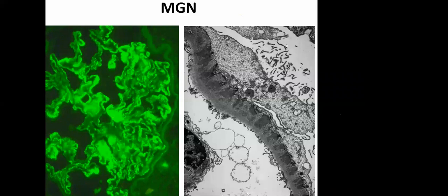The exact localization of deposits, whether they are along the capillary loop or mesangium, can be determined on electron microscopy. The further localization of deposits, whether they are subepithelial, intramembranous, or subendothelial, can also be commented on only on electron microscopy. So looking at the immunofluorescence, it is impossible to say whether these deposits are subepithelial or subendothelial. Okay.